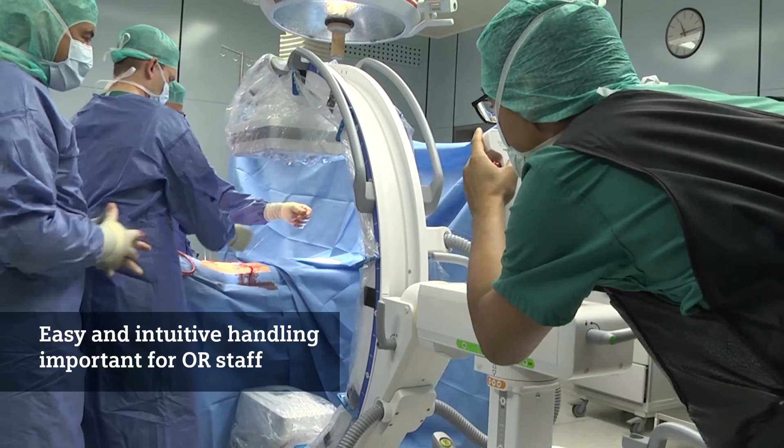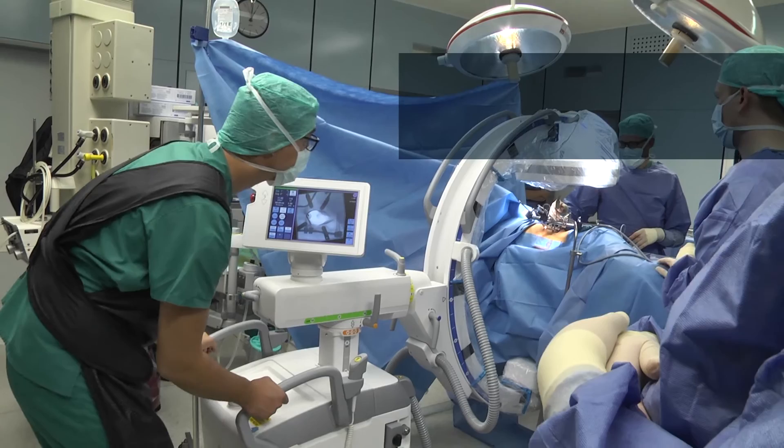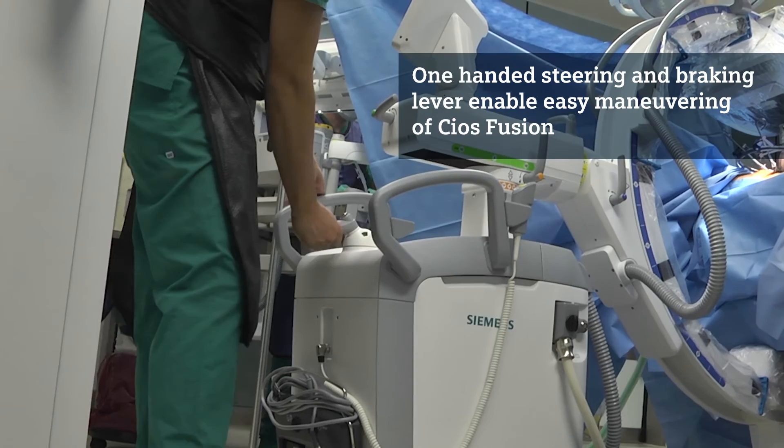For the team it's very important that a C-Arm is easy and intuitive to handle. To move the whole C-Arm you have a one-handed steering lever — you can move the C-Arm in different directions and also use the brake to fix it in place.